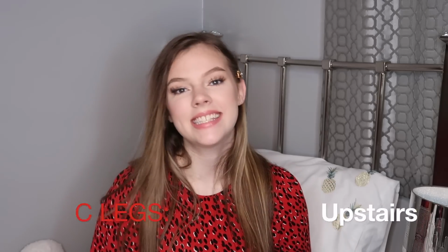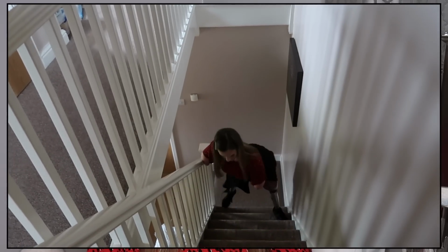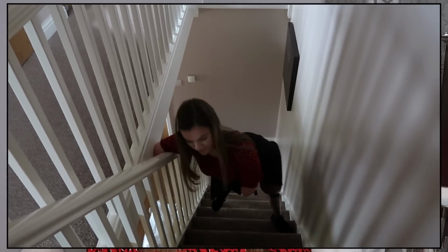Okay, the next one is stairs up. Now, going upwards up the stairs hasn't really changed since I got my blades. I can bend them a little bit more to make it a little bit easier getting up the stairs, but it's about the same. If you're not aware of how I go upstairs, I'll include a clip anyway, just to make sure that you all know how I do it.